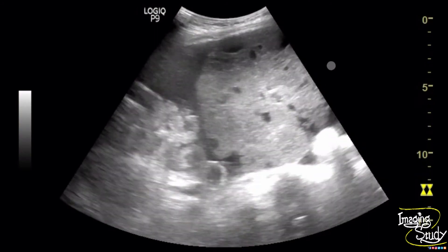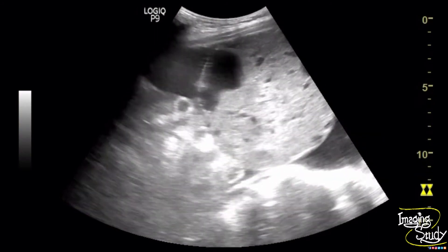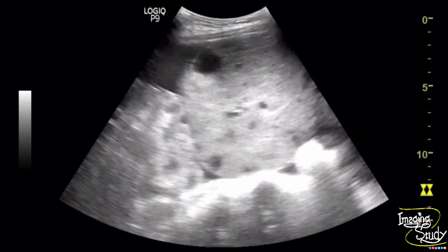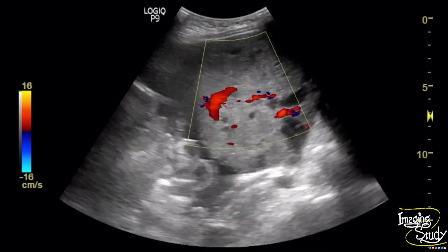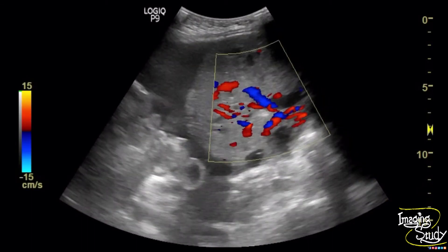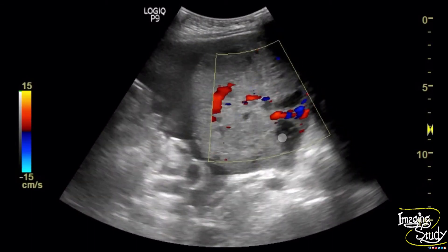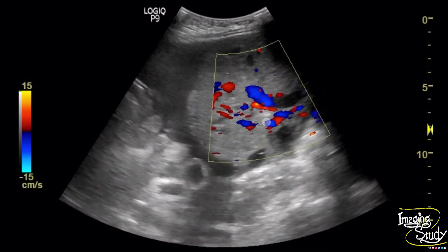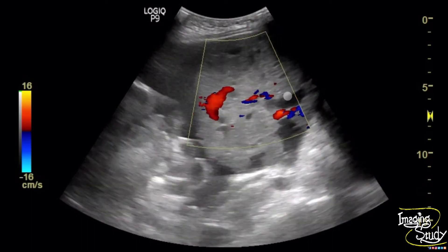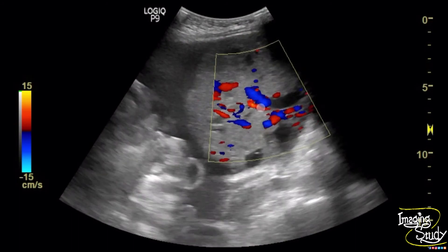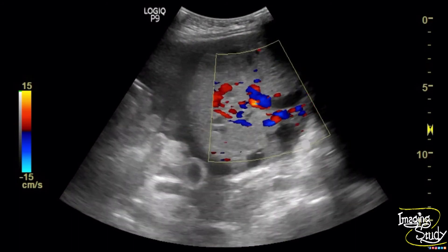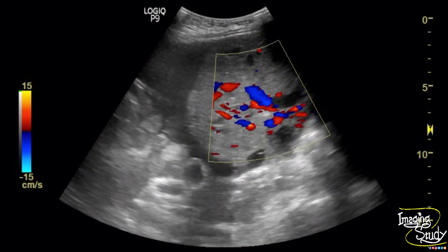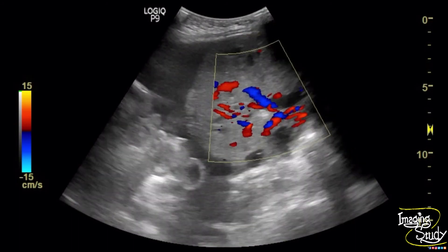Again, here is the lesion, and when we make the PRF low, we can see a huge amount of vascularity within the lesion which was getting missed due to the high PRF setting.